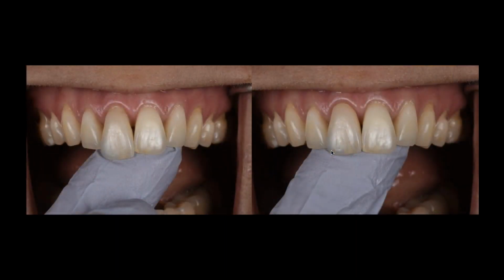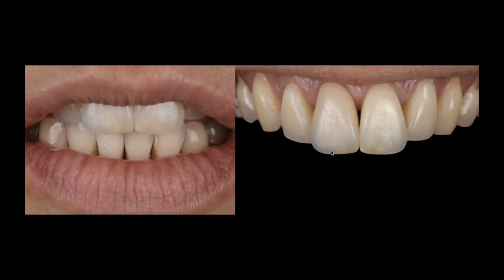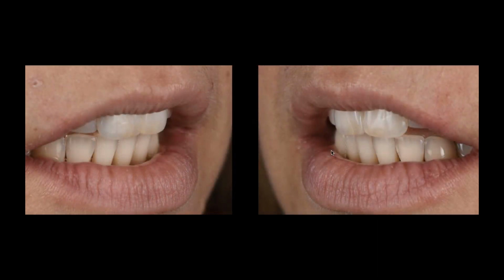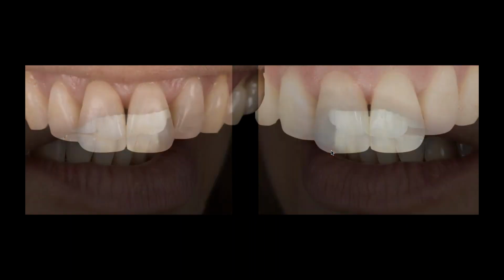And you see as I slide that in the patient's mouth, it kind of harmonizes fairly well. It's got a very similar density, and that's important. Color-wise, I have the zones of chroma, value, and translucency. And the only way to really test yourself at the end is under polarized, right? Take that polarized shot, and you can see that we got a really fairly nice value match and chroma match across the board. And that's what really matters. It's not cemented yet at this point, but you can see that that's what we're getting out of it.